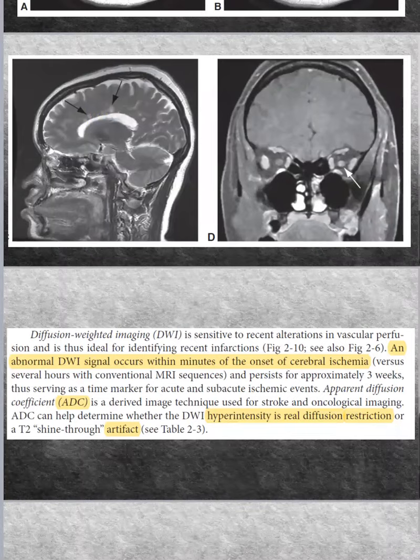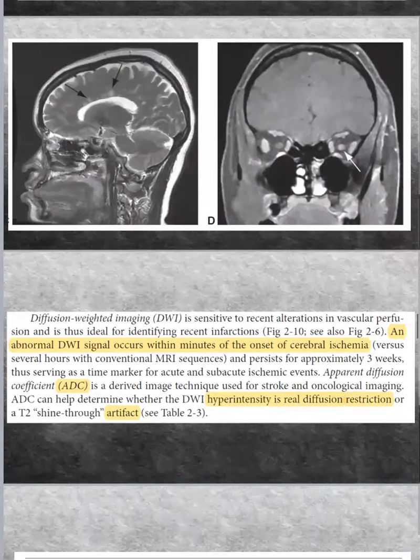Okay, here can you see the difference between the optic nerve in the right and the left eye? Here and here, can you see the difference of the optic nerve? Here in this arrow, it is more bright. Okay, this is suggestive of optic neuritis. So these are clues for diagnosing using these modalities or this MRI.